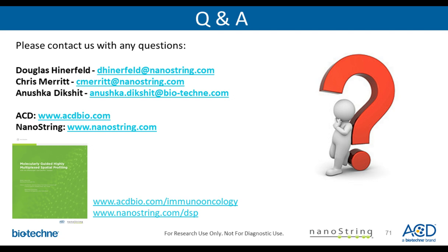Thank you. On an average, how many base pairs long is each Z probe? Hi. So a single Z probe can bind to around 18 to 25 base pairs on the target. So on an average, I would say 25 for each Z probe. So 50 for a pair. Thank you. Okay, your next question. What kind of method do you use to validate your RNA-scope data?